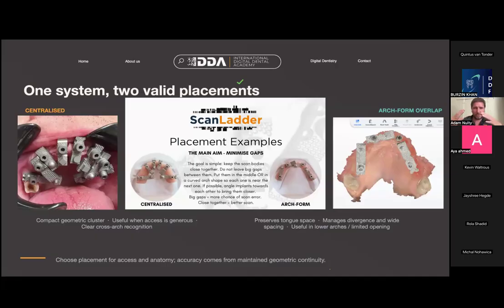overlap those scan bodies. We want to record the data without scanning the soft tissue first. That's the key. And that also should note, if we're taking the soft tissue, we don't want to record the soft tissue first and transfer that to the implant scan and then add to that with the scan bodies. Because if we do so, we're transferring the error from the soft tissue scan to the implant scan. The implant scan should be done all on its own.